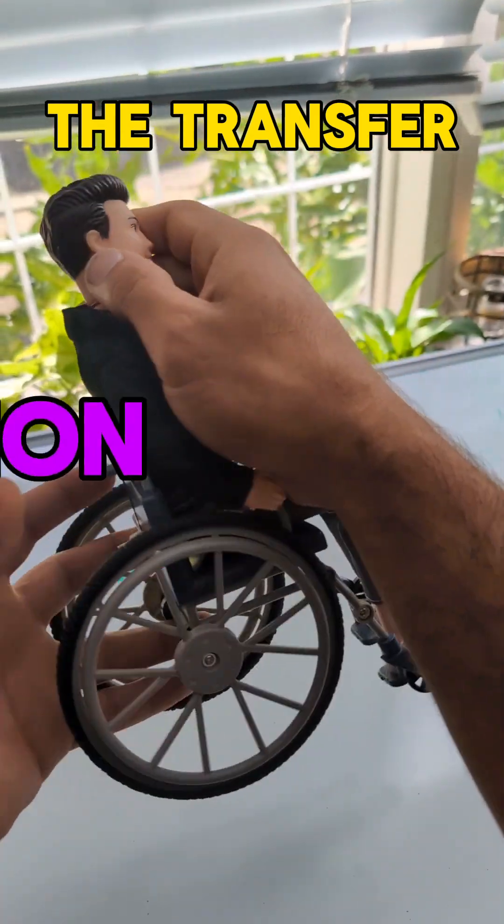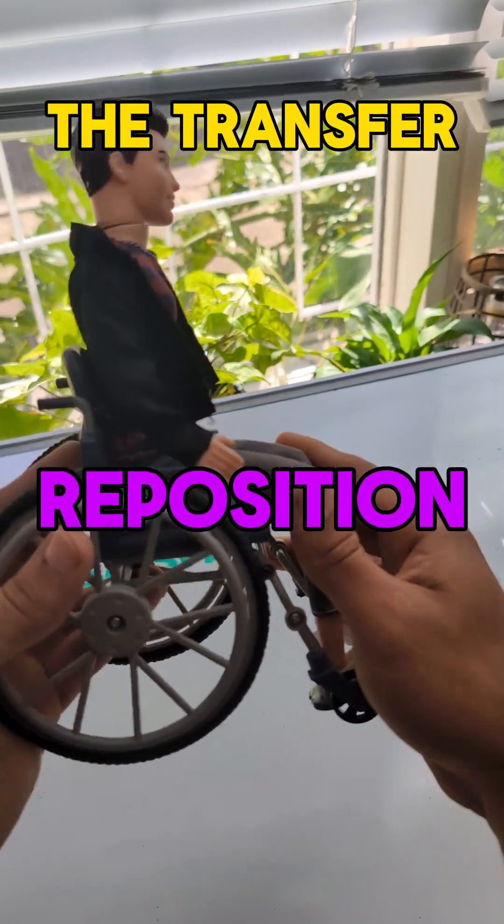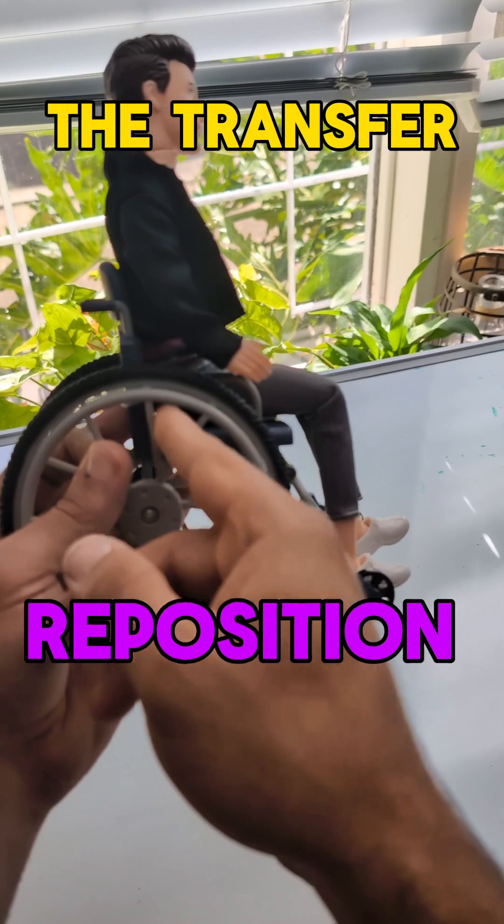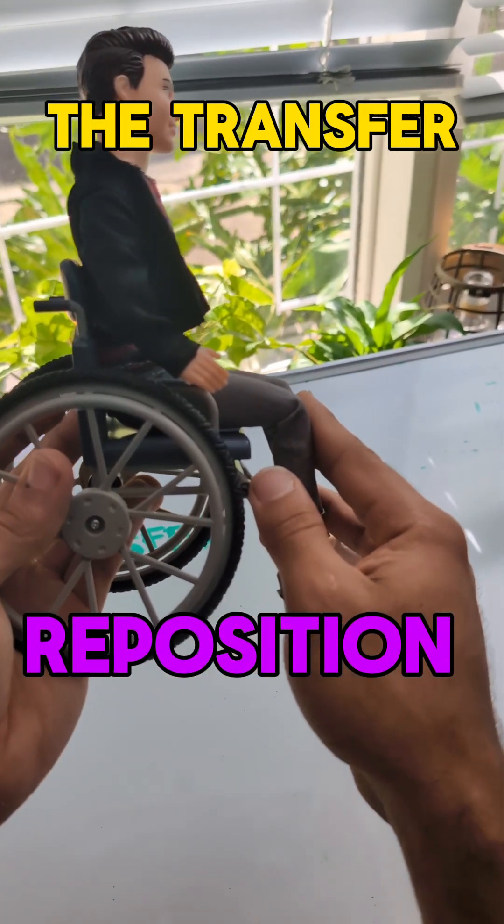The number one thing you can do is ask the person to lean forward. Lean forward and see if there's a gap between their backrest and their bottom, and try to close that gap as much as possible.